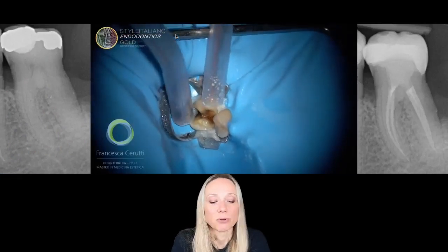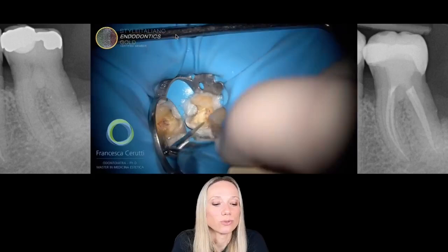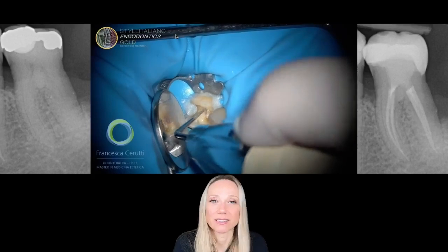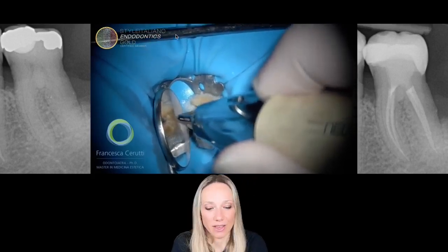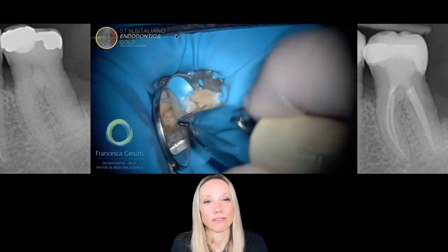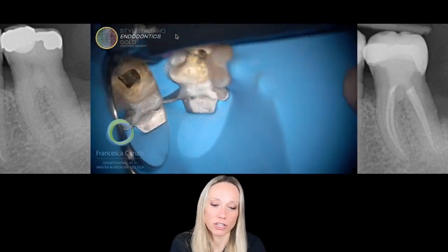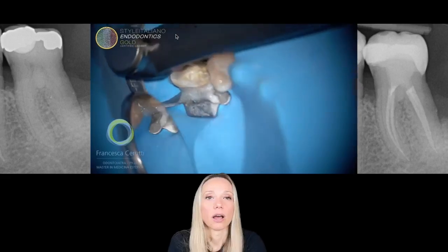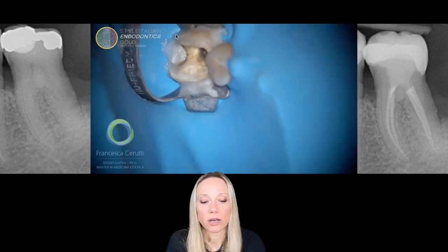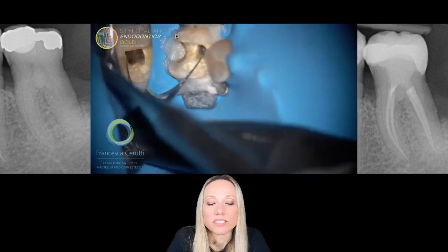In this case, it's these periodontally compromised teeth that are sent to me by my periodontologist. What do I do? I do the same. So first of all, remove completely the coronal restoration and then remove completely the decay. In this case, you will be able to evaluate which kind of post-endodontic restoration fits the most this situation. And then you go. I do my pre-flaring. How? 1303. And you see, I do it in every root canal. And then the same sequence.